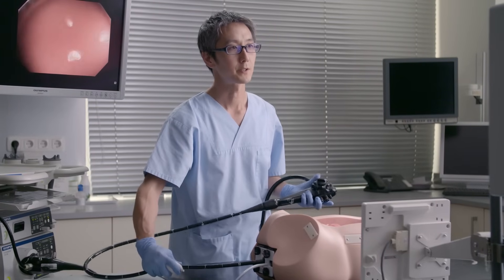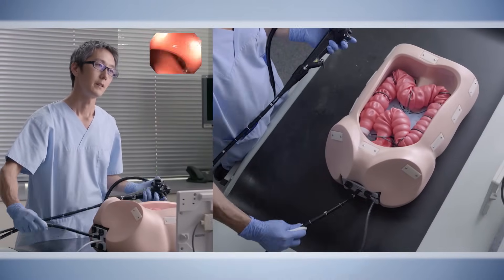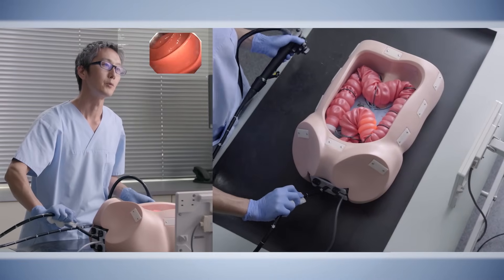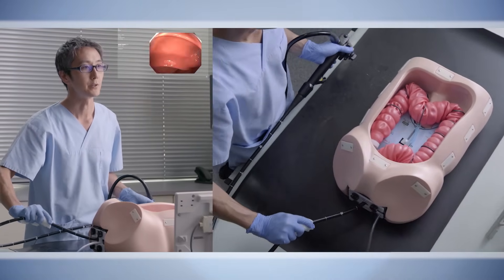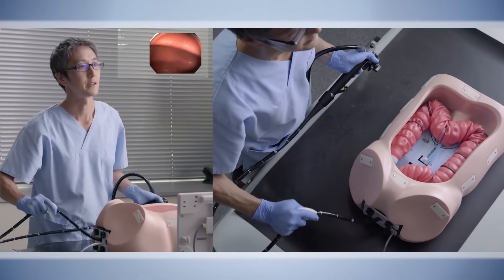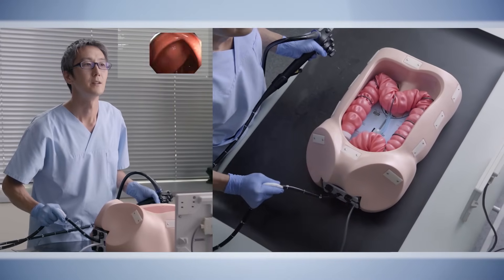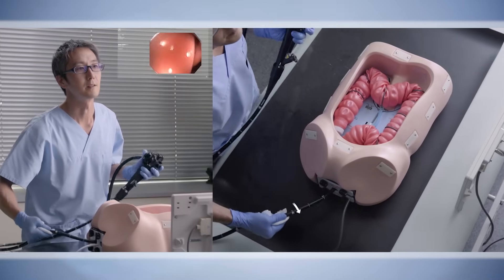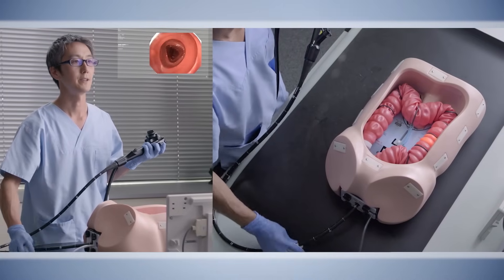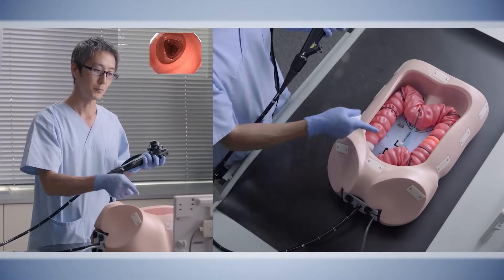The first part of colonoscopy is trying to shorten the sigmoid colon. In this actual demonstration with the phantom, the real goal is to shorten the sigmoid colon even without making a simple loop. With this technique, you always try to maintain the axis of the colon into the descending colon so that you wouldn't have any loops in the sigmoid colon. As you can see, now the sigmoid colon is straight.